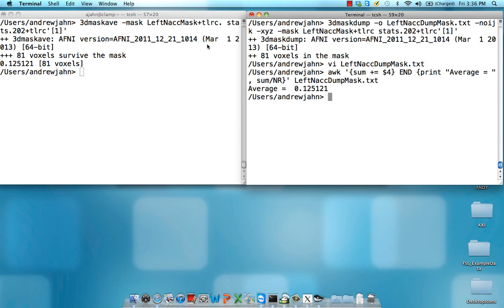So you see here that these two values are identical. They're the same thing. Just mask dump gives you slightly more information because you can see each beta estimate at each voxel.